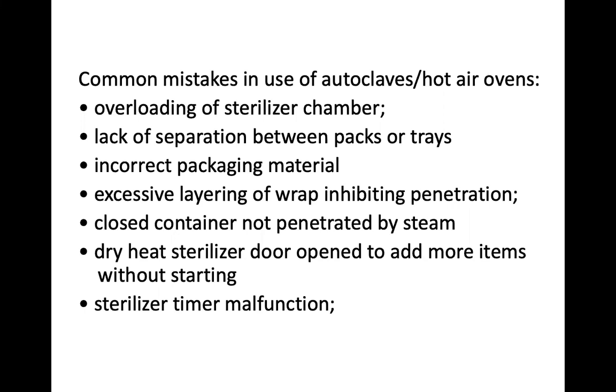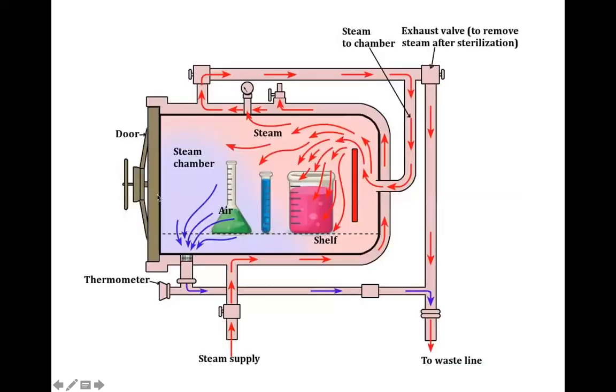Some of the common mistakes is overloading the sterilizer chamber. This is the sterilizer chamber. When you overload it, you pack it too much, the steam cannot sufficiently perfuse through the items, between packs and packages, and even get in. And even in a hot air oven chamber, it should not be too packed.